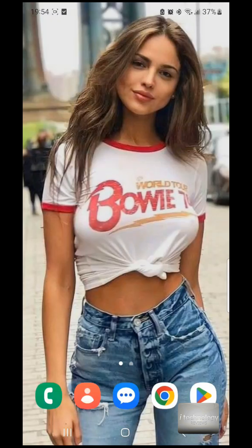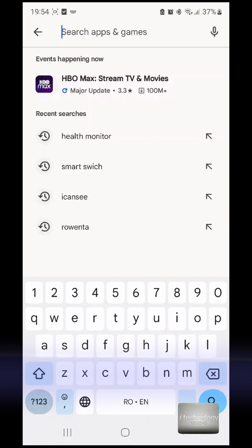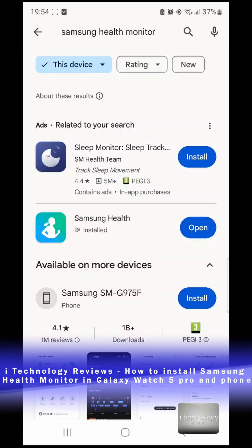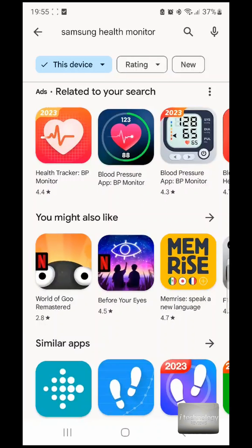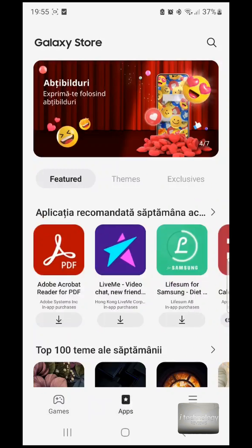You know this application — it's not accessible if you are looking for it on Google Play and you search Samsung Health Monitor or Health Monitor, you will not find it. But there is a purpose and a procedure to install it on your phone. A lot of you asked us what application we used for measuring blood pressure or ECG, and even in the Galaxy Store you will not find it.